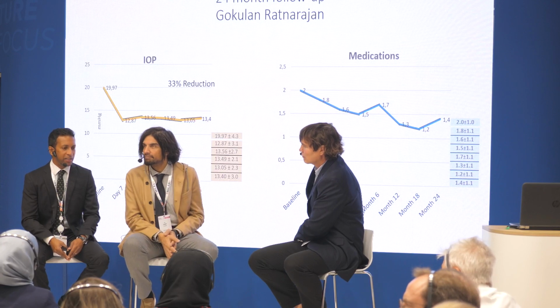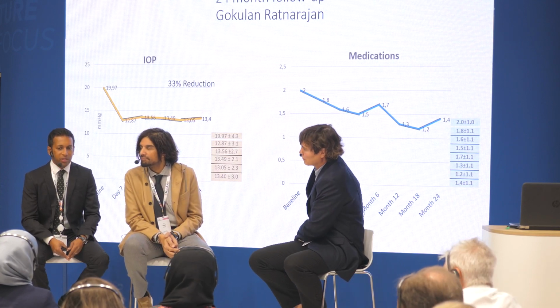So yeah, as you said, there's that initial financial outlay versus buying a procedure that's cost per unit. But the fiber optic cables, as long as handled carefully and not bent, and because it works through total internal reflection, you can use these cables several times. Well in excess of a dozen, probably two dozen if you look after it. Yes, the image quality does go down. So after the initial outlay, the cost of each surgery is essentially nothing, because you've got the instruments there.